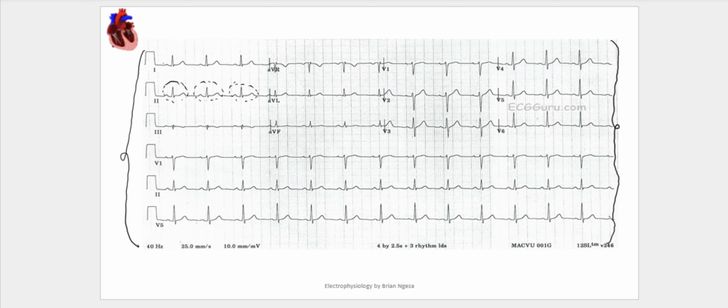You can clearly distinguish various areas of the heart. You can examine lead 2, lead 3, and these other leads, so that sometimes this could be normal, but maybe you have an abnormality with the V6.